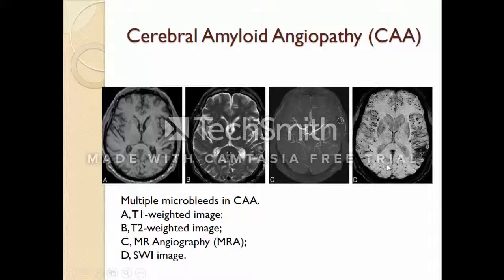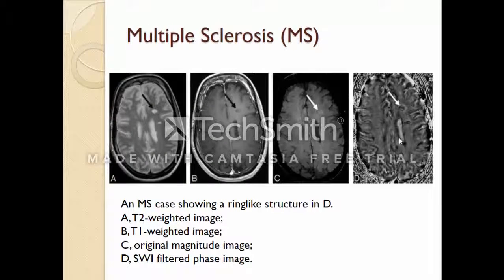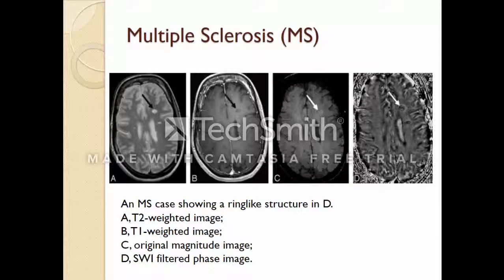You can also see these little dots as microbleeds distributed all over. Multiple sclerosis, called MS, is a relatively common acquired chronic demyelinating disease involving the central nervous system, affecting both the brain and spinal cord. Here is a special case of MS. In T2 weighted, T1 weighted, and the original magnitude image we can see this MS case. But due to iron deposition we can see a ring-like structure around some MS lesions, with iron appearing in a ring structure and a smaller amount scattered inside the lesion, appearing darker.